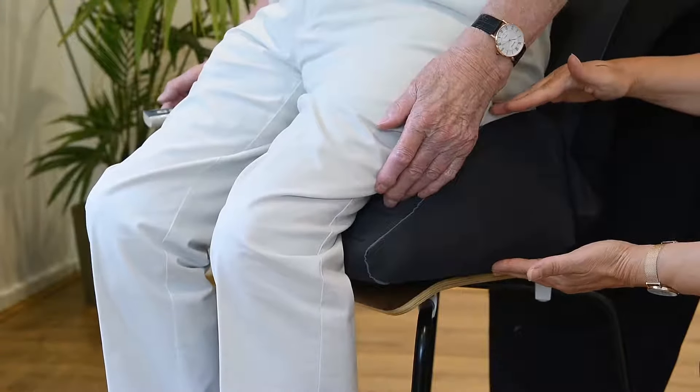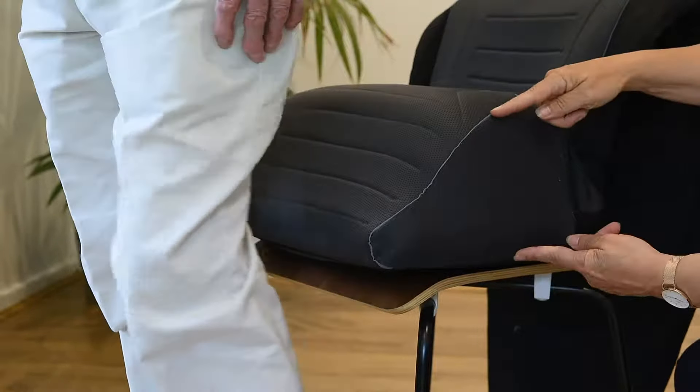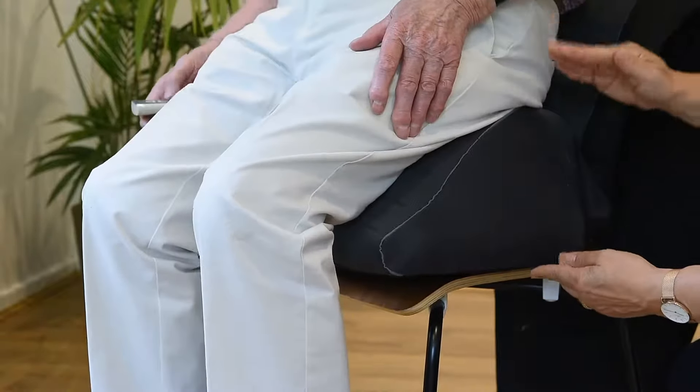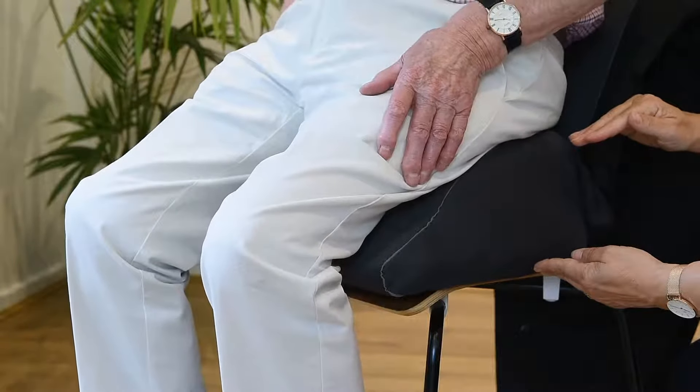The SitnStand's four cells can be used independently, allowing the seat to be used with clients with different popliteal to heel lengths.